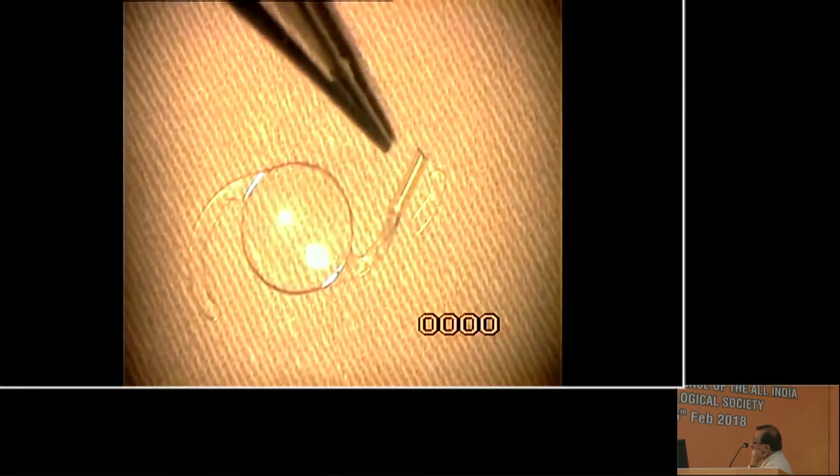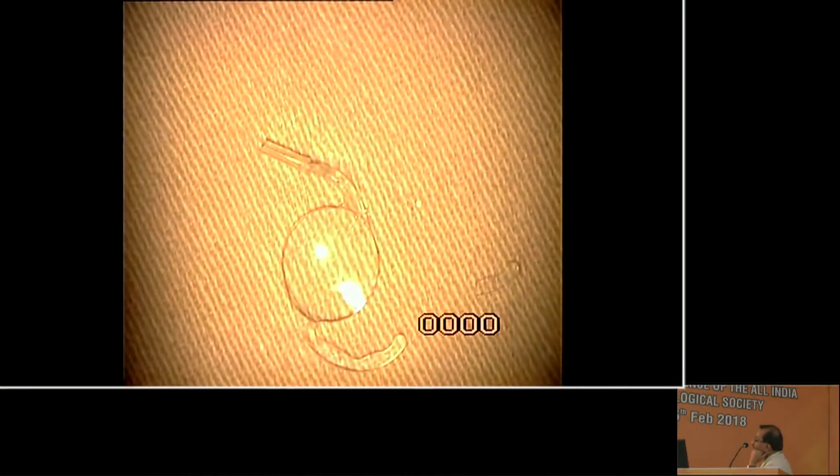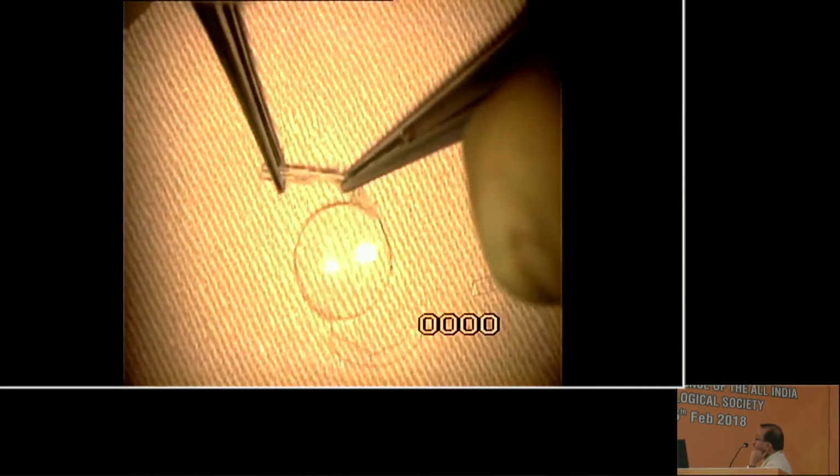An exact length of the silicone tubing equivalent to that of the cut portion of the haptic can be placed over the cut end of the haptic, and this is reasonably stable as is seen from this traction test. This avoids meddlesome anterior chamber maneuvers during explantation.